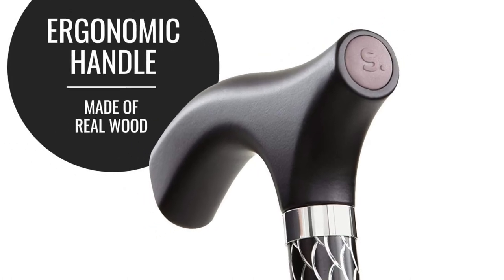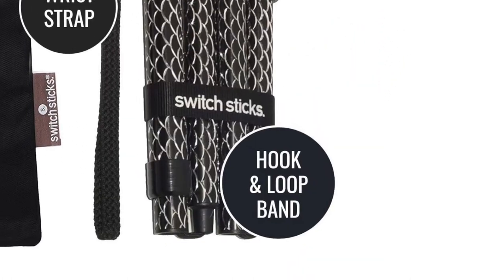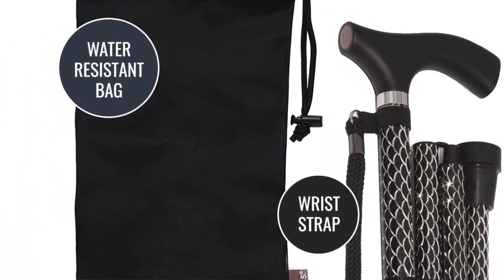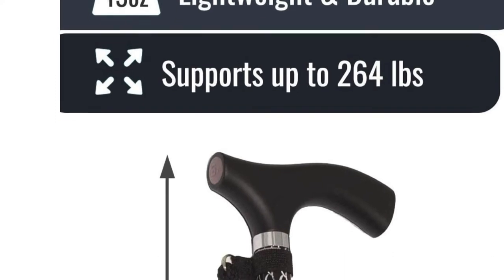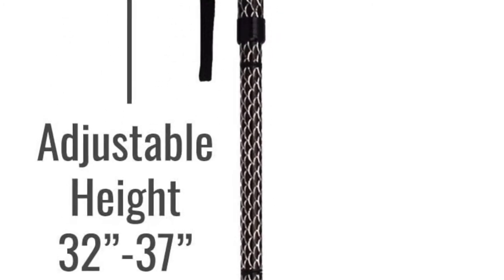To use the Switch Sticks Walking Stick, first open it up by pressing the button on the handle. You can then adjust the height by pulling the sections of the cane apart or pushing them together. Make sure you tighten the section by turning the black knob on the bottom. To close it, just press the button on the handle and fold it up.